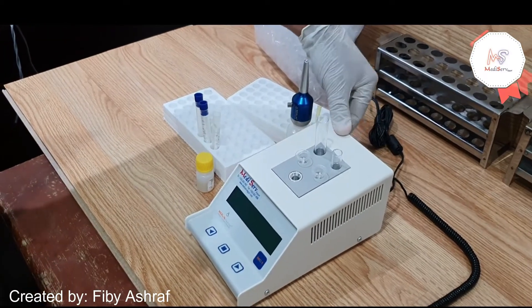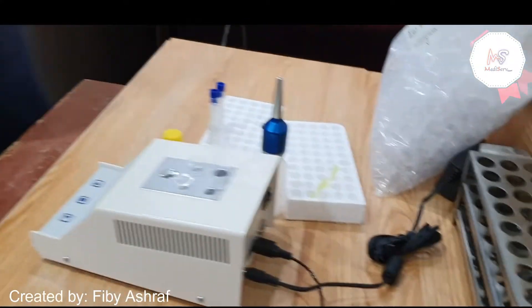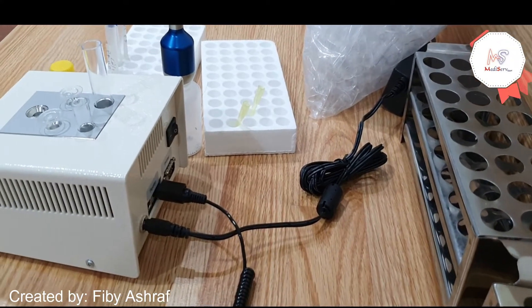First, switch on MC1 and allow it to warm up for 15 minutes. For the reagent vials, leave them to come to room temperature, and if possible leave on the bench overnight.